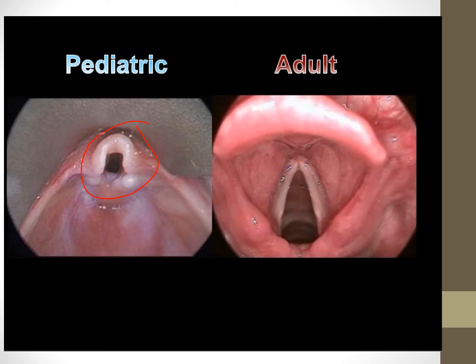And that's also why neonate endotracheal tubes don't have a cuff on them. They don't have a balloon on the tip, because if we use the right size ET tube, we're not going to need that cuff, because their body has an anatomical cuff. So you need to know the difference between the smallest part of an airway for an adult, the glottic opening, and the smallest part of the airway for a child. It is not the glottic opening, right? So there are going to be big differences here.